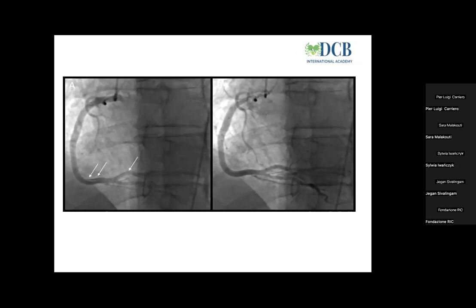Is it a later angiography, after two to three weeks? No, same patient, same day. Okay, second injection. In the second one, there is something proximally that is not clear, because we should see it in movement. It could be either a vasospasm or a dissection starting from the catheter and going through the entire vessel. That's another hypothesis.